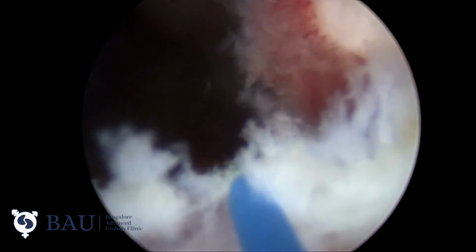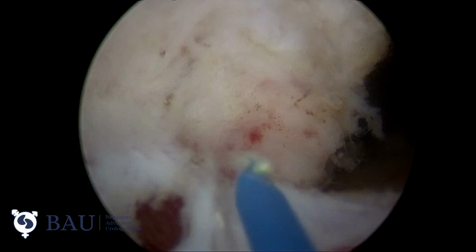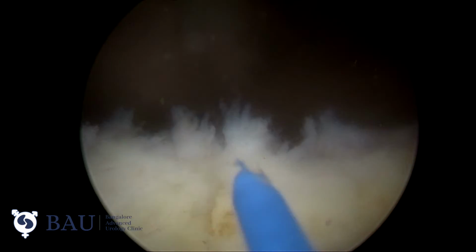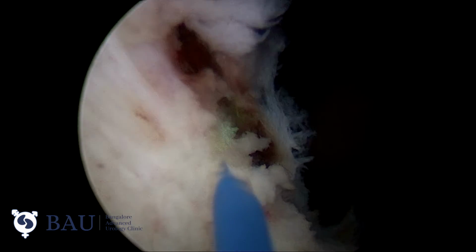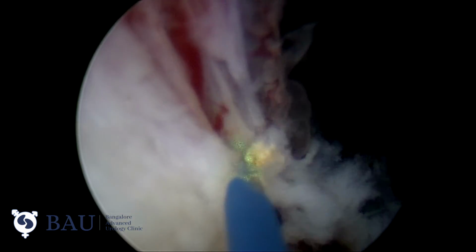Here also we should be extremely careful while cutting the fibers. We have to orient ourselves to the ureteric orifice. Better to close the outflow so that the bladder will be full and we can finish off the final part.